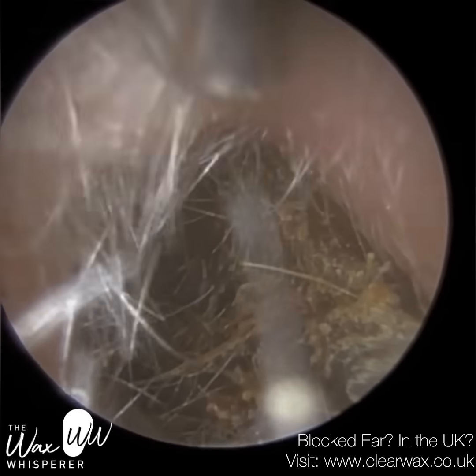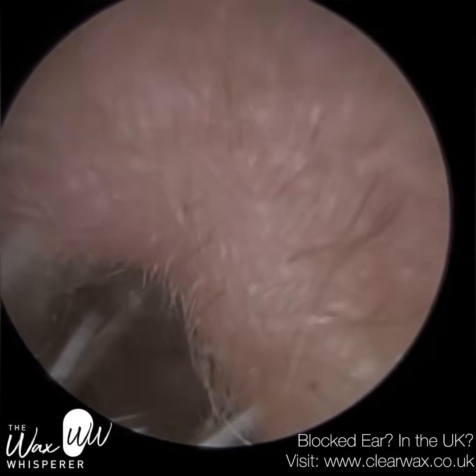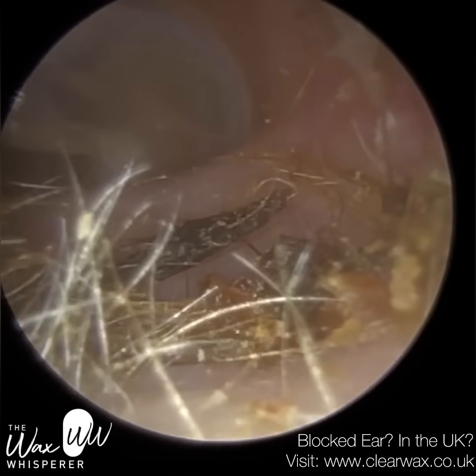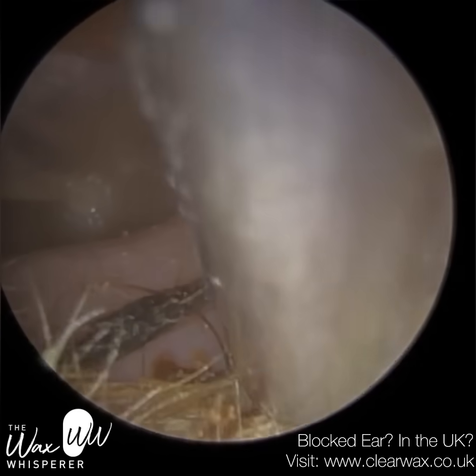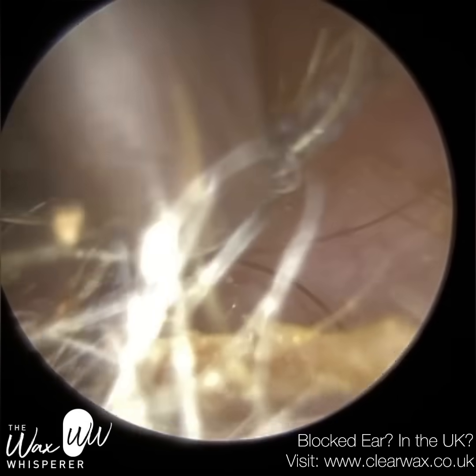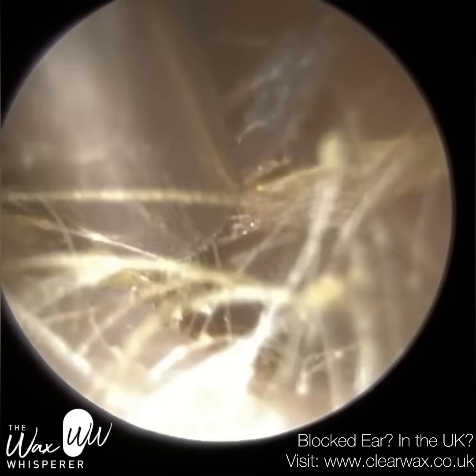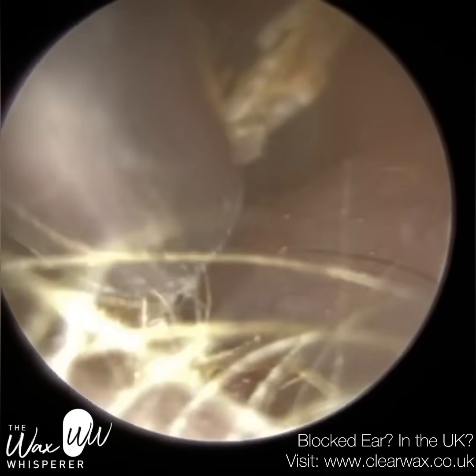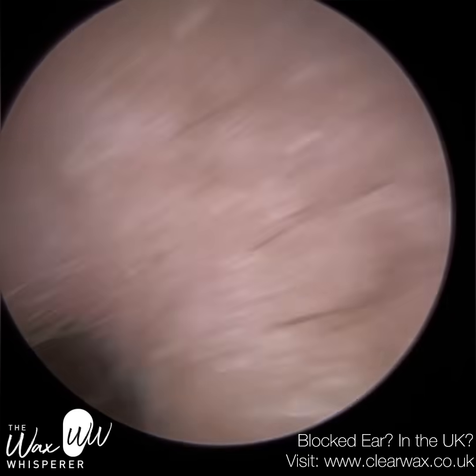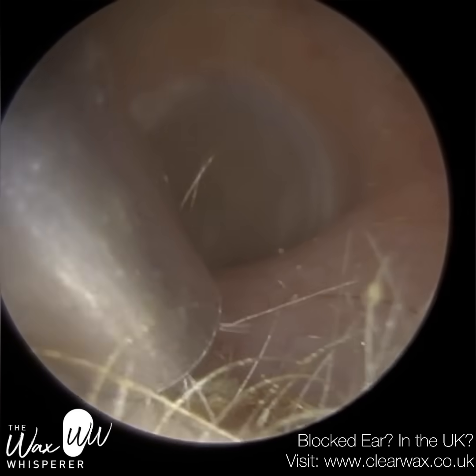So just peeling some skin off here. It's really dry and crusted. There's a few hairs matted. Just a little bit left at the base. Let's just get rid of that. So I'm just using the fine end, just gently peeling it away, but mainly here on the cartilaginous portion of the ear canal. So we can afford to apply a bit of pressure on the ear canal without causing any pain or trauma to the patient. If we're on the bony parts of the inner 2/3 of the ear canal, we're going to be very, very careful because it can be uncomfortable for the patient.